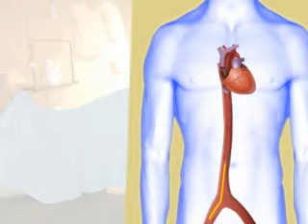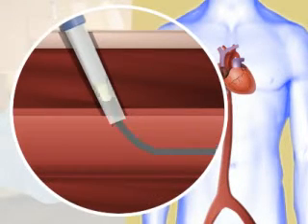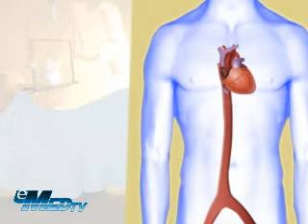Once the procedure is complete, the doctor will take out the catheter, but the introducer may remain in the artery. The doctor leaves the introducer in place for a period of time in case signs of artery reclosure are encountered or happen.